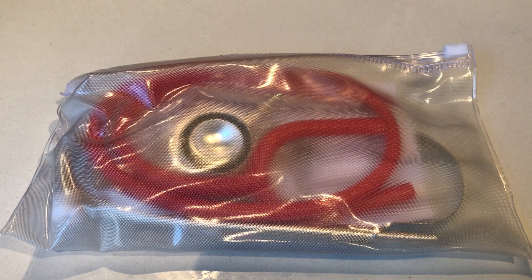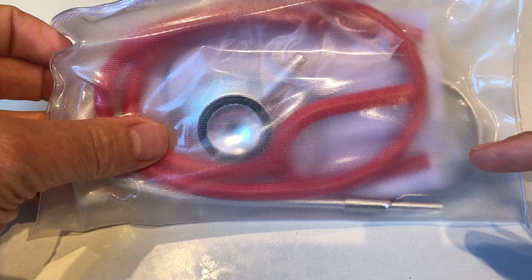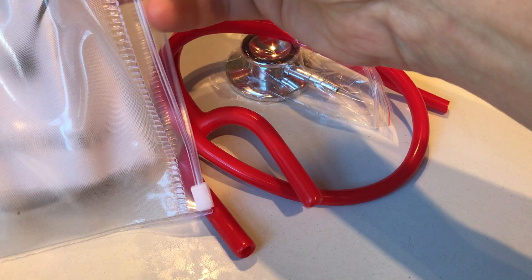Welcome to this product demonstration video for the ValueMed Dual Head Stethoscope. Packaging when it comes to you is going to be a flat-packed unit in a sealed plastic zip case like this. The one demonstrated in front of you has the chest piece, the tubing — this one's a red one — and on the other side you've got the sprung steel headset. Let's take this out of the packaging to show you it more clearly.